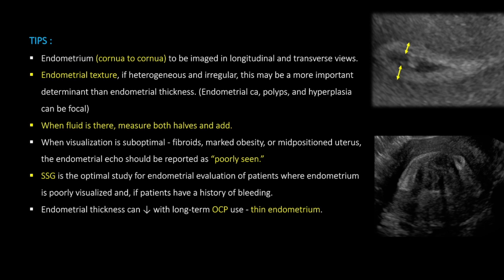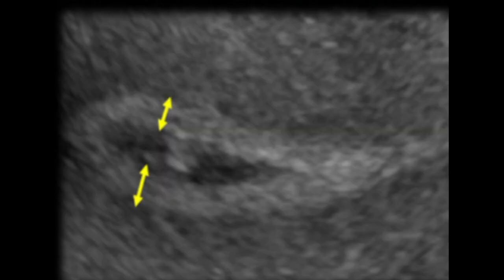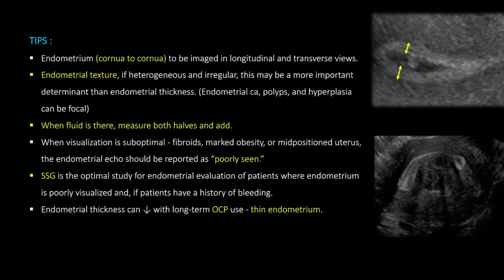When there is fluid in the canal, we do not measure it as part of endometrial thickness. Instead, we measure each layer of the endometrium separately and add them — as seen on the right side of the screen, if there is minimal fluid in the canal, we measure the anterior and posterior lining separately and add them; two millimeters plus two millimeters gives four millimeters total. If due to fibroids, obesity, or uterine position we cannot see the endometrium properly, we should state that it is poorly seen, rather than reporting a potentially false normal measurement.